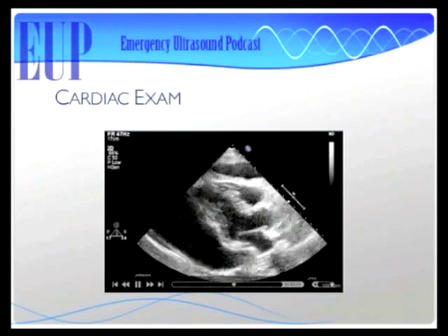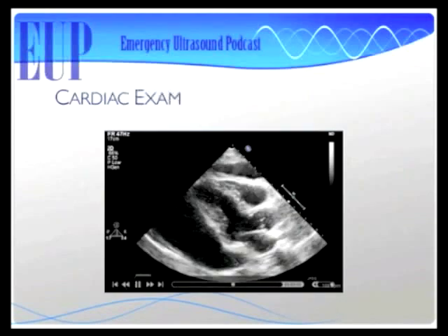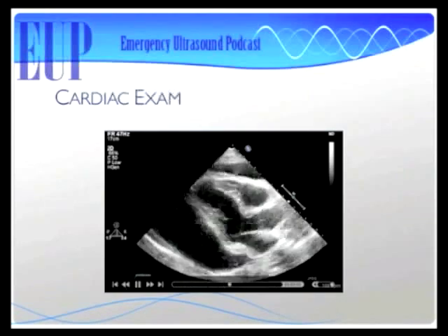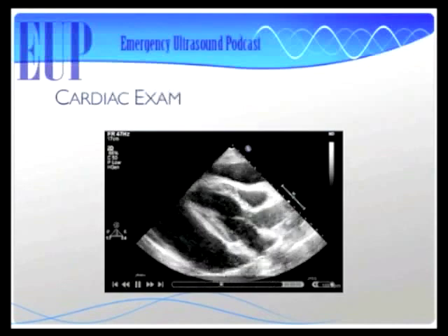You're not looking for little subtle findings. You want to know, does the heart squeeze well? Is there any evidence of a PE? Is there anything else that could be causing the patient's dyspnea? So now we're going to talk about the IVC.